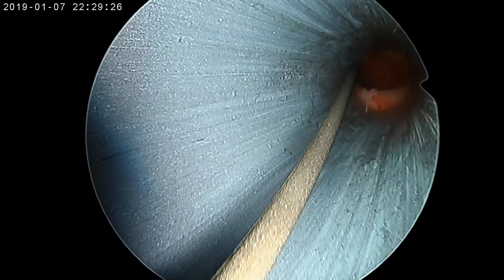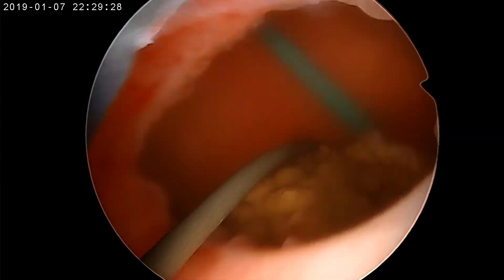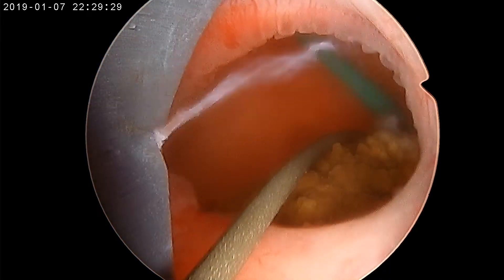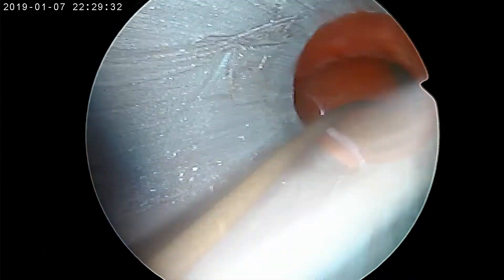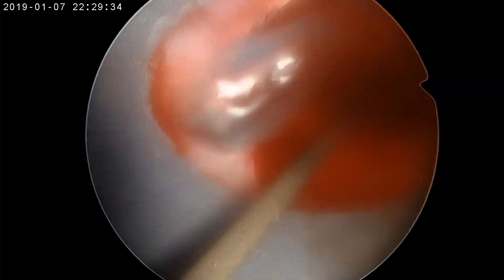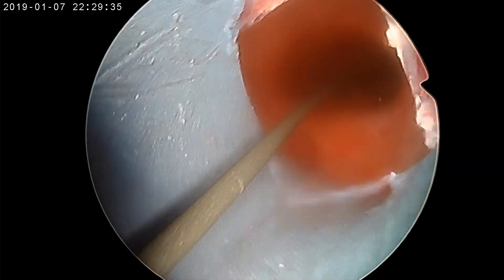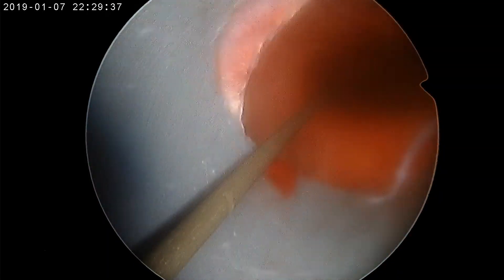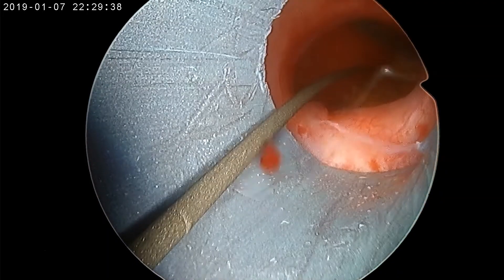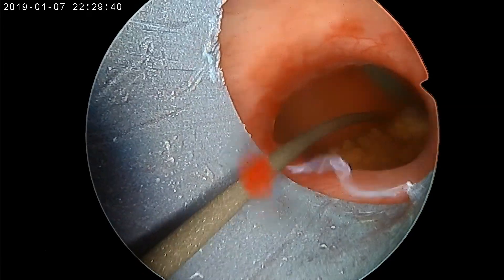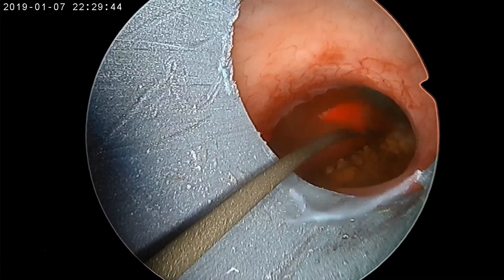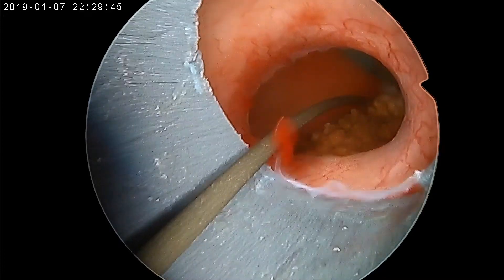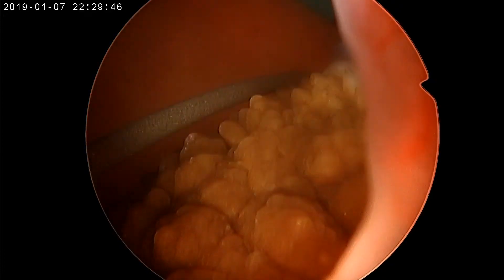The same calyx is confirmed on endoscopy. When pulling the Amplatz sheath slightly back, the punctured calyx is visualized — this is the mid posterior calyx. A perfect puncture is confirmed by the infundibulum being seen directly in front after entering the calyx.